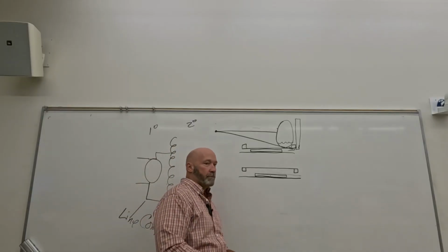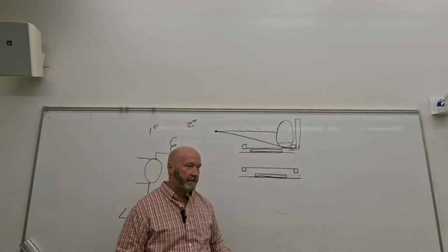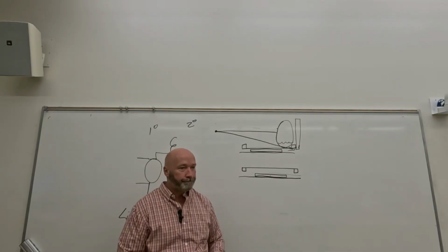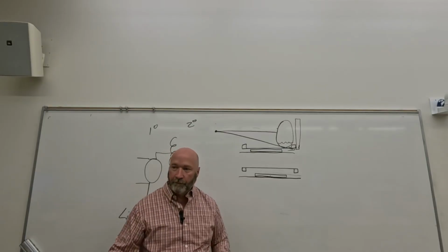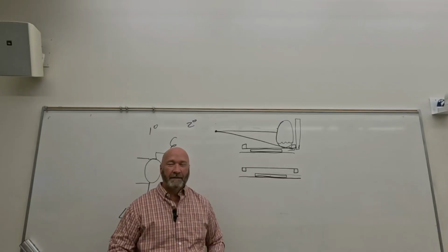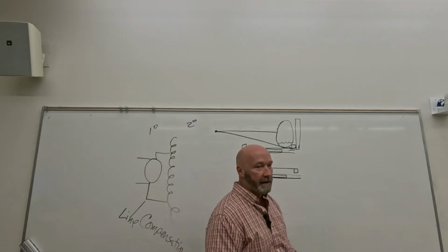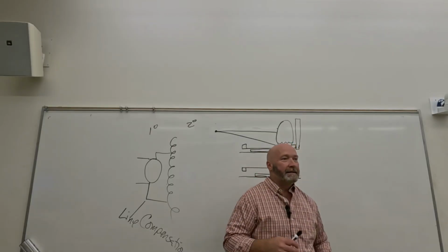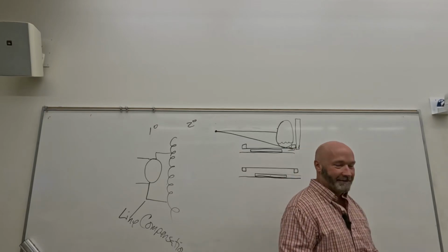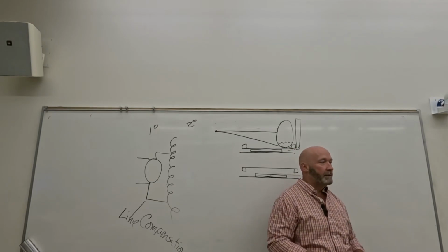There are benefits to both of those as well. The free floating ones are typically just going to be in your diagnostic rooms, not your RF rooms. You step on it and you can move the patient pretty quickly, and you can get them anywhere that you want to go with them. So you tend to see those in just your diagnostic rooms and your trauma rooms, things like that. The downside to those is, let's throw back to the last chapter, what controls those locks? What do we call that?